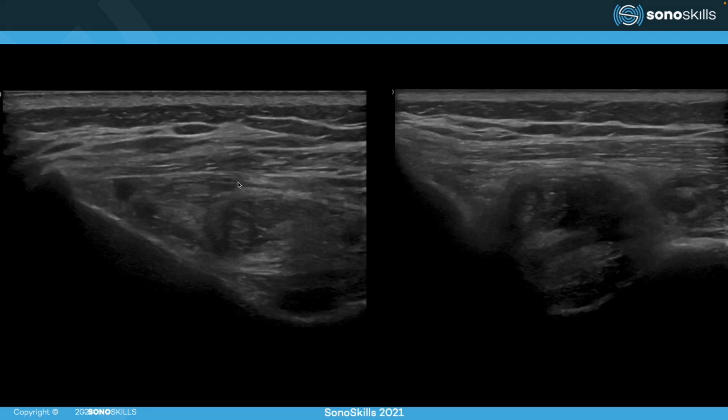And here we can see a muscular problem, a tearing of the muscle, also fatty infiltration of the infraspinatus muscle. And while contracting this infraspinatus under ultrasound guidance, you will see that the muscle is dysfunctional and that not much contraction is happening due to the fatty infiltration.